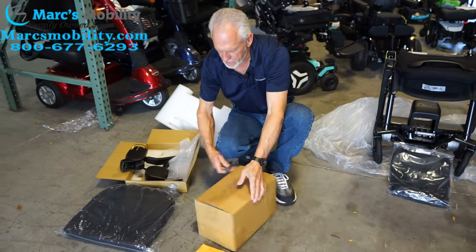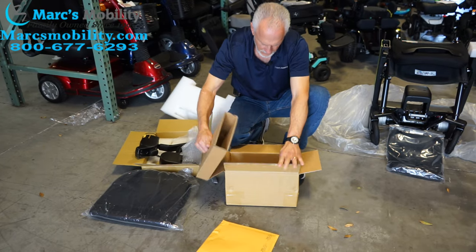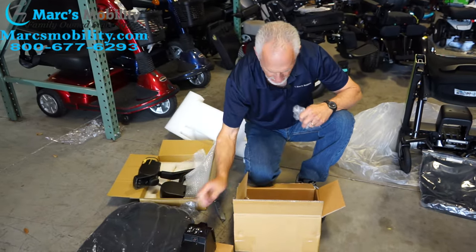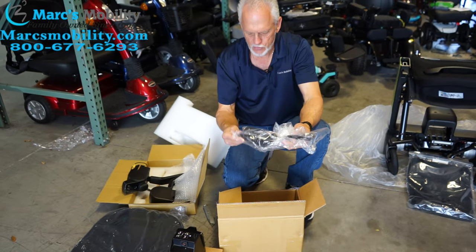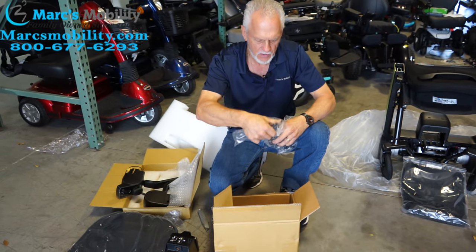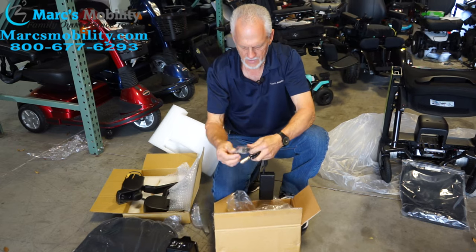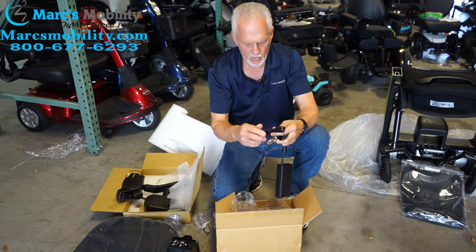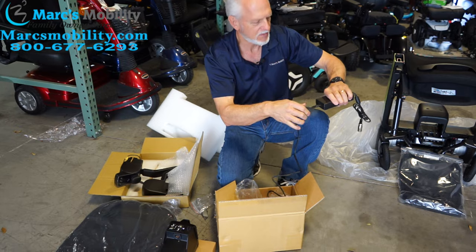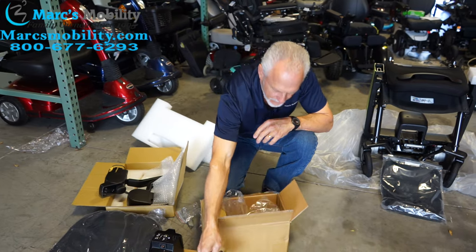We're going to open this box here and see what's in here. So here we have your battery pack, and you will have your charger. Your charger is here — be careful, there's a cord in the bottom of the box for your charger. So when you pull the charger out, you'll have to take this cord out also. Make sure you plug your cord all the way in. Sometimes people don't plug it all the way in and call back saying it's not charging. Make sure that plug is all the way in — this will be your charger.